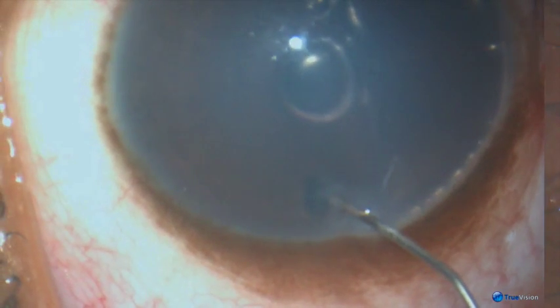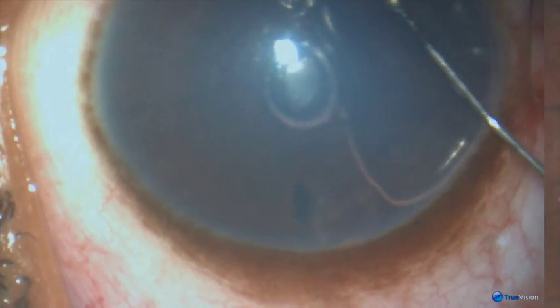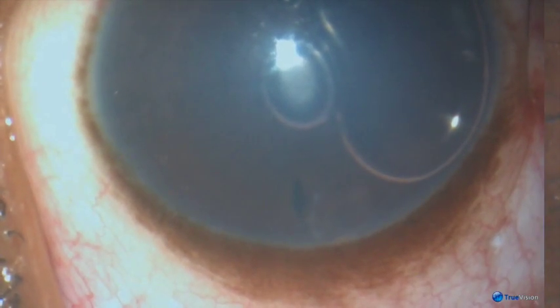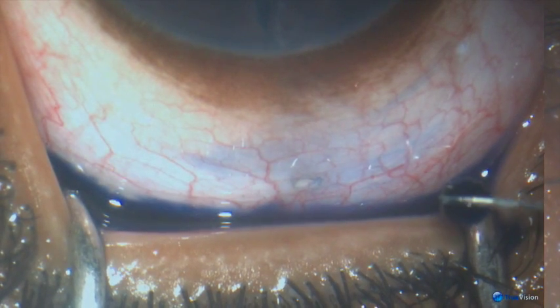Washing out the pigment and putting sodium hyaluronate inside the anterior chamber as a temporary block on the inside. Because of the sodium hyaluronate, no fluid is coming out at the moment.